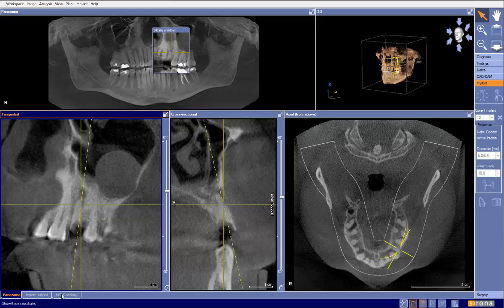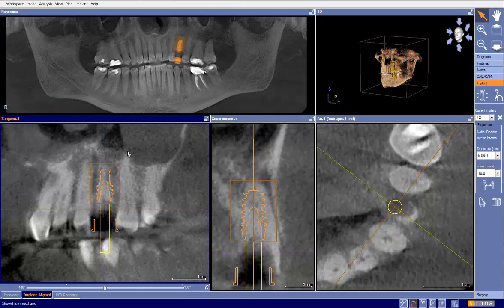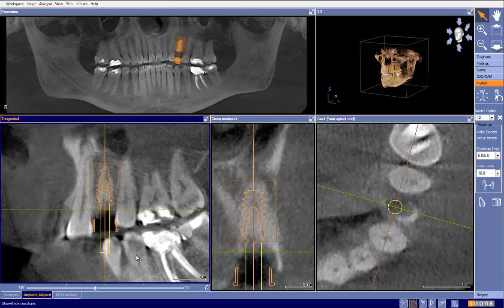Now let's go ahead and focus in on the implant. So the big question here is on immediate placement. Based on a plan that we have here, a premolar, it is my intention to generally go with the 4.3 millimeter implant. Although the space may exist for a 5.0 implant as was initially planned here, what I have found in most people is that it gets too close to the root surface of the adjacent teeth. My preference is usually to try and go with a 4.3.